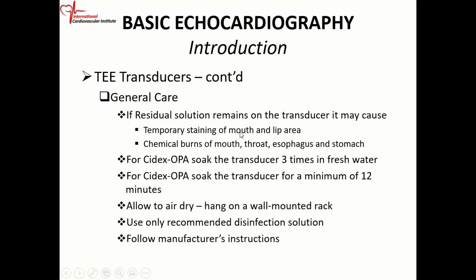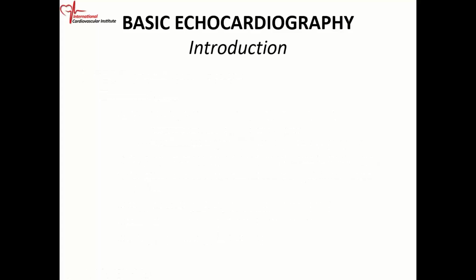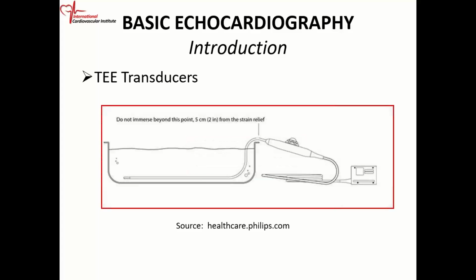If it's not cleaned properly, patients can get temporary staining of the mouth and lip area, and the cleaning solution sometimes can cause burning of the mouth, throat, and esophagus. So when you clean the transducer, make sure it's properly rinsed off. Allow it to air dry, okay? You can hang it on a wall mount and allow it to dry. Only use the disinfection solution that is recommended. Do not use anything that is not recommended.